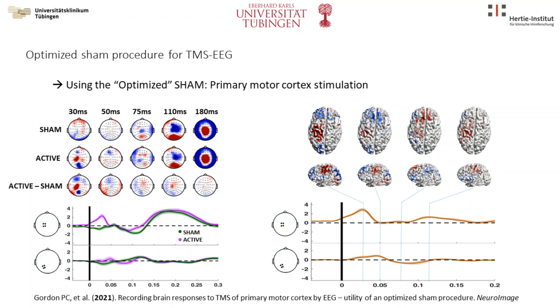Now, these results here are not new, as they have been described and suggested by many previous studies. What we're doing here is mainly emphatically confirming that these can only be ascribed to the direct cortical activation by TMS and not to peripherally evoked responses.